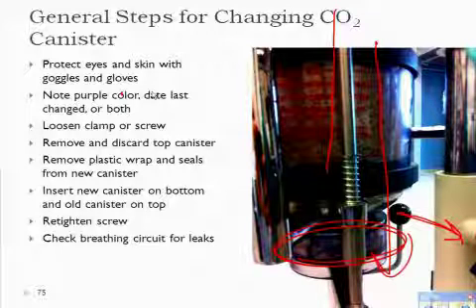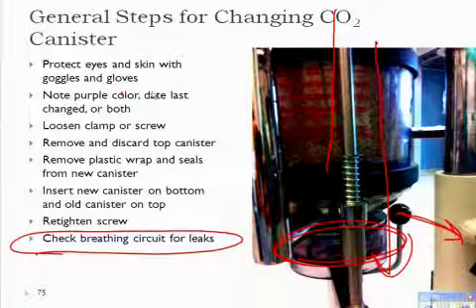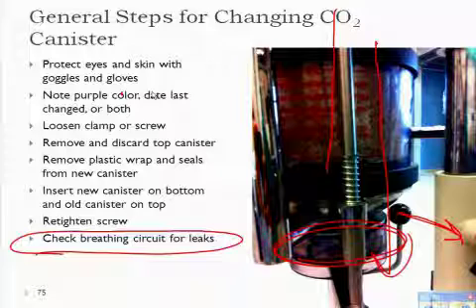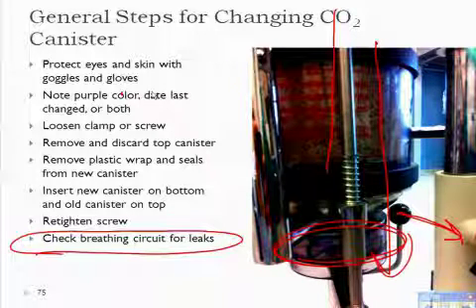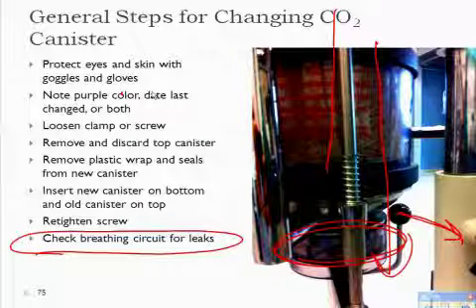Now, this is imperative. You always have to check for leaks. Now, I'll explain what that is next semester when you come in and you do your machine checks. But anytime you do anything in this machine, you need to recheck it. And this is a frequent thing that happens.